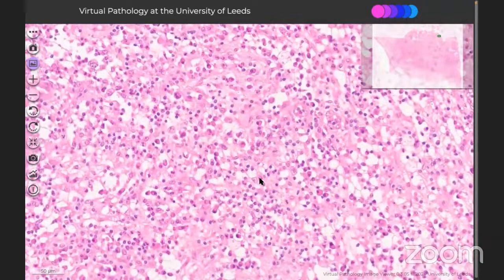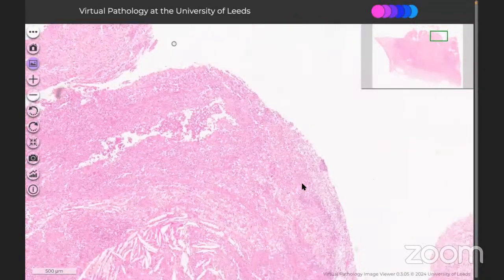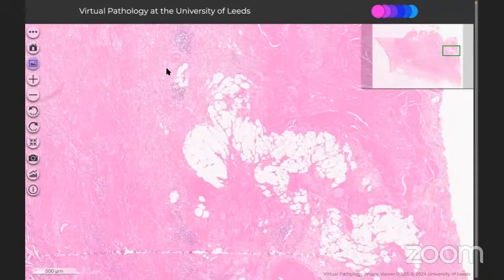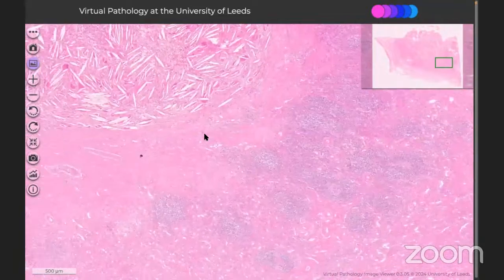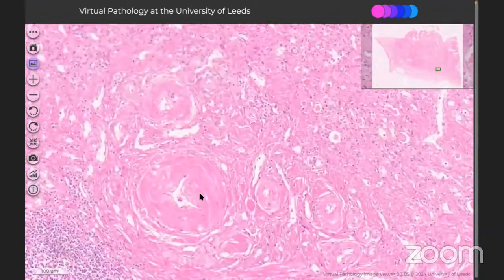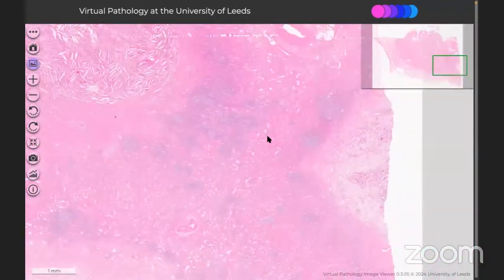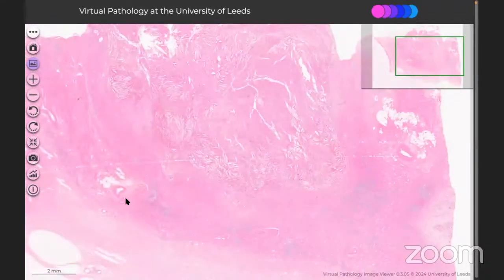So you can say these are the risk factors, and this is a kind of end stage renal disease. The kidney has been sacrificed, and there is no granuloma or atypia in the surrounding kidney, and the patient should be followed up because there is already evidence of hypertension. So this is a medial hyalinosis, a well-established feature of hypertension going on. The patient can be followed up in nephrology OPD, and CPC can be done for this case.